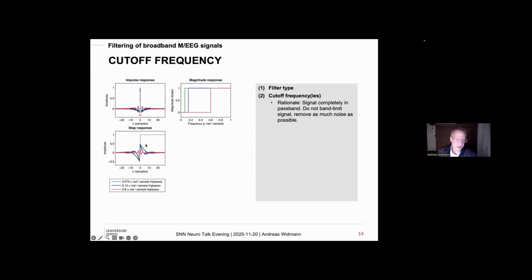And almost similar for the high frequency part, just the other way around. The more high frequency I remove, the more flat the signal will get, but you will also have this kind of filter ringing artifacts here. And you already know where this comes from. So I think that was why I introduced the first part, because it's really hard to explain where this filter ringing type comes from. That is really because you removed essential parts of your signal.